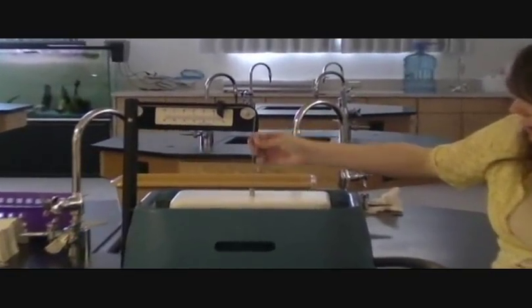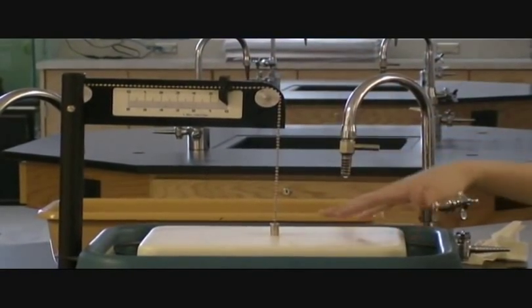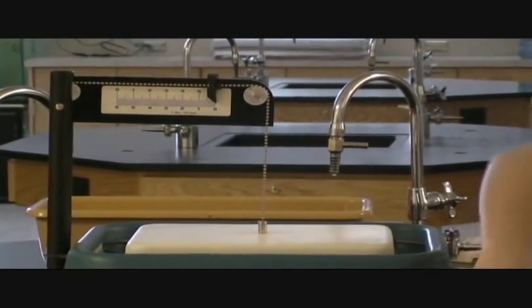Up here we have this chain, and on the chain is this moving piece. So when you blow in, this thing is going to raise, because the air is going to come into the tub and lift it up.